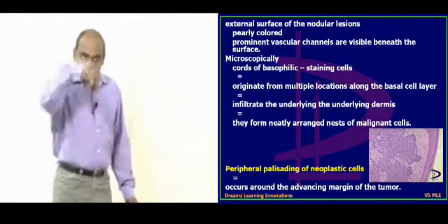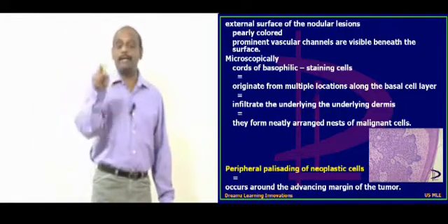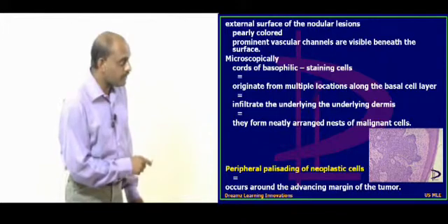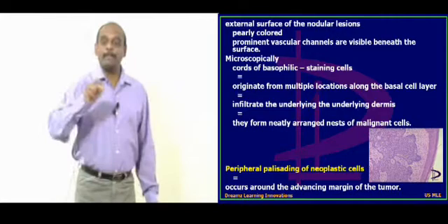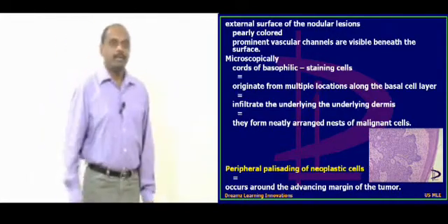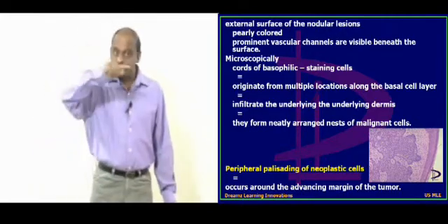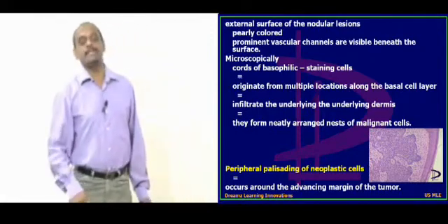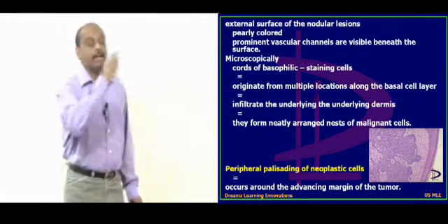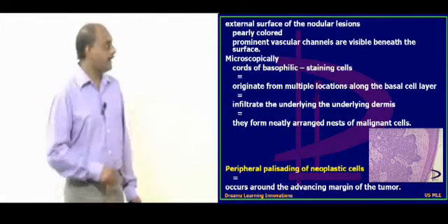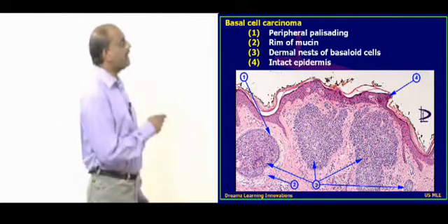Along the basal cell layer, they will be infiltrating the underlying dermis and form neatly arranged nests of malignant cells. This identification of nests of cells is very important before you write your final histopathology report as a basal cell carcinoma. In advanced stages, they develop peripheral palisading — peripheral layering of the neoplastic cells — with nests infiltrating the dermis, involving the stratum basale, with basophilic staining.